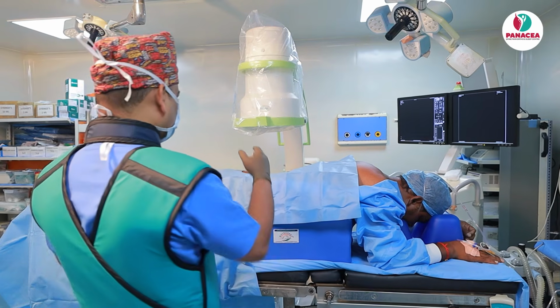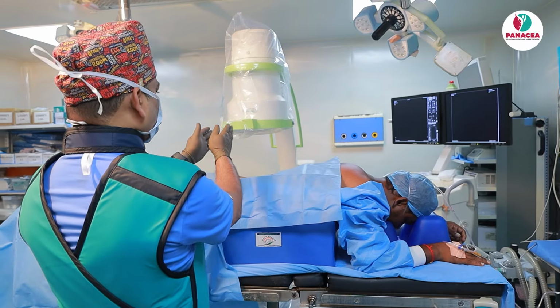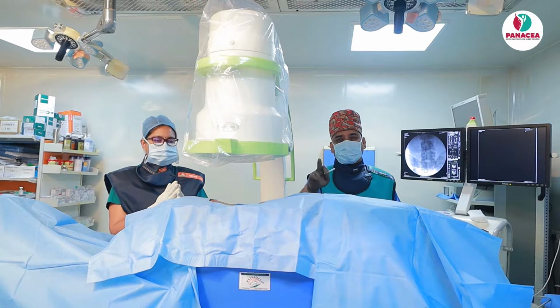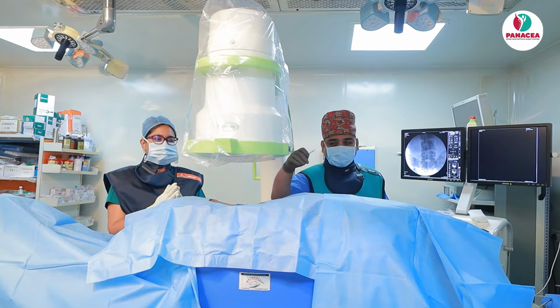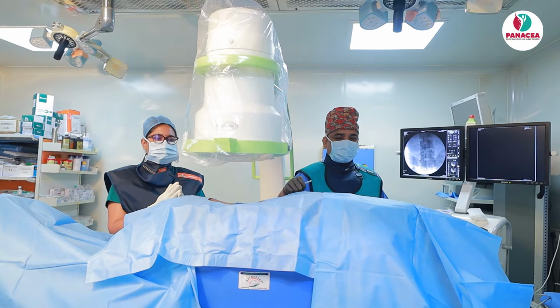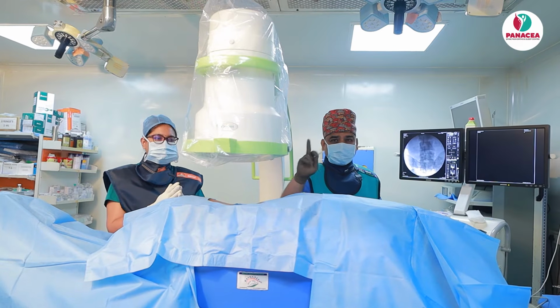I am standing on the opposite side, so I should be exactly opposite to the C-arm. Now your first fluoroscopic view is the AP view, in order to know that the spinous process is equidistant from the pedicles. Now you can see the fluoroscopic image. They have taken the first AP picture.